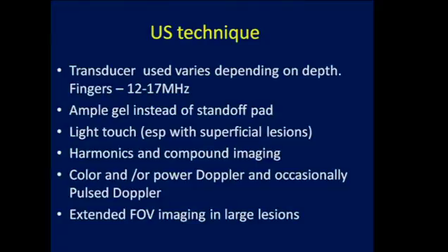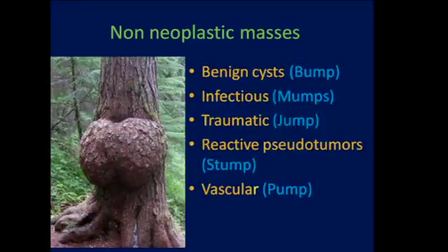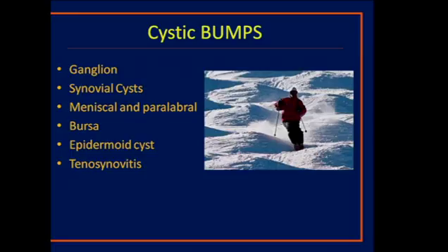I'll use harmonics and compound imaging to see fluid structures as well as to better evaluate the borders of the lesions. Color and power Doppler and occasionally pulse Doppler is used, and extended field of view imaging in large lesions. I've separated the non-neoplastic masses into large categories: benign cysts, infectious etiologies, traumatic, reactive pseudotumors, and vascular etiologies. So let's start with cystic bumps.